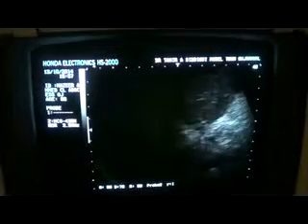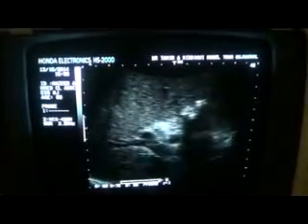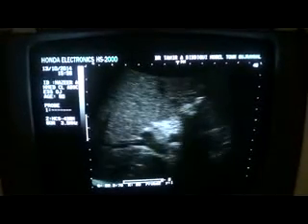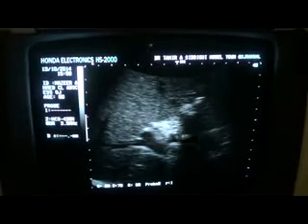And moreover, what we see is that in the gallbladder, these are the echogenic areas that you are seeing, which shows muffled walls. These are the calculi within the gallbladder. Now the gallbladder shows muffled walls. This is the portal vein, common bile duct.